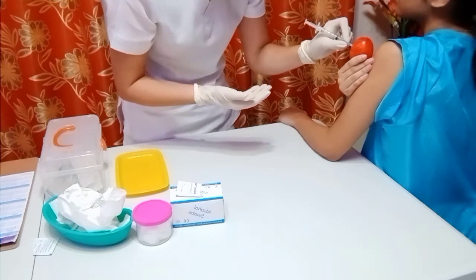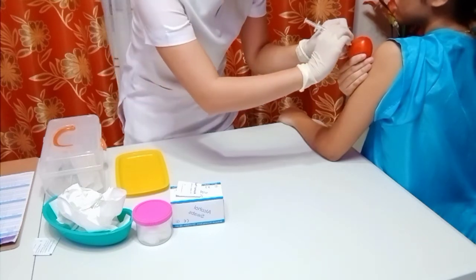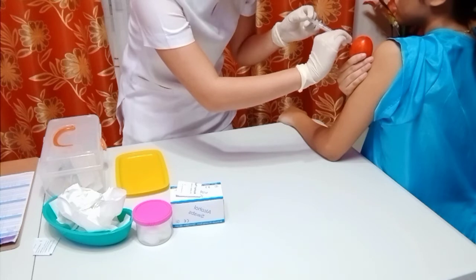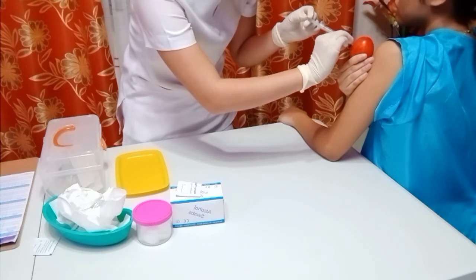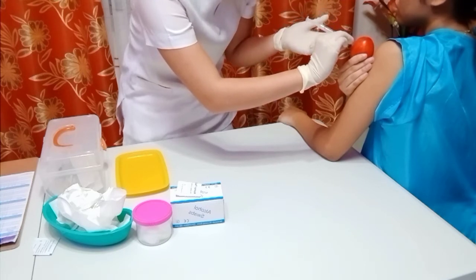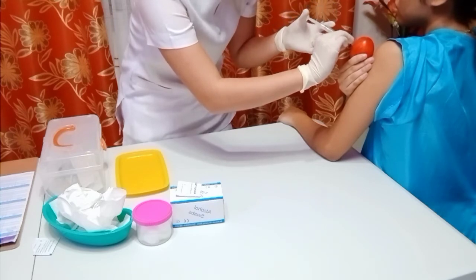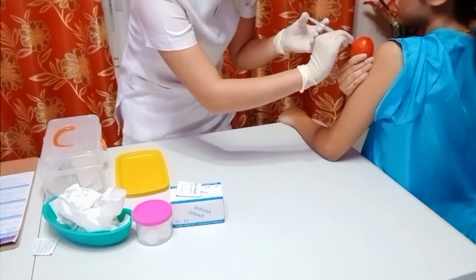Hold the barrel of the syringe steady with non-dominant hand and aspirate by pulling back on the plunger with your dominant hand and aspirate for 5 to 10 seconds. A serious reaction may occur if a drug intended for intramuscular use is injected into a vein. Then slowly inject the medication. Rapid injection of medication can lead to speed shock.